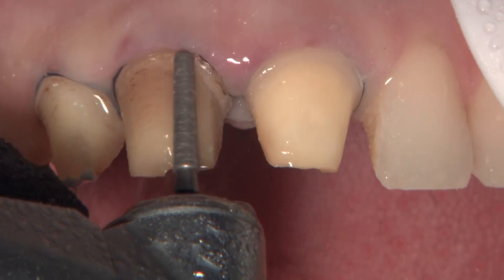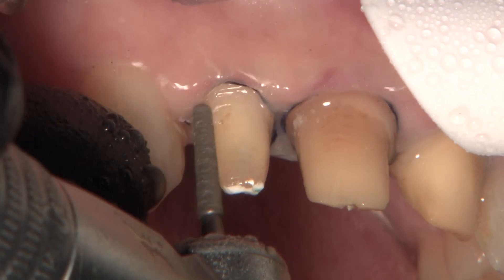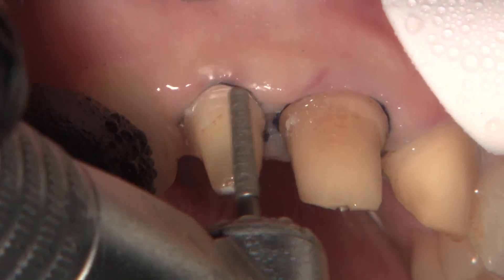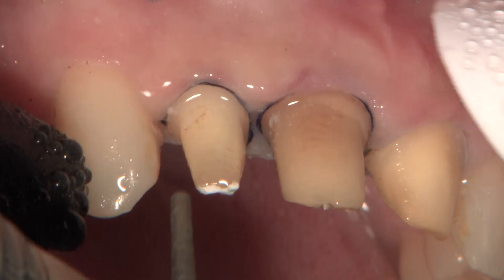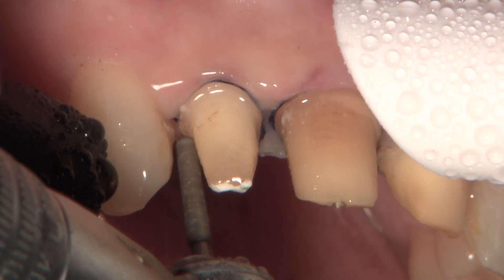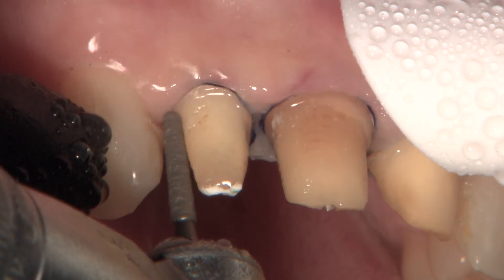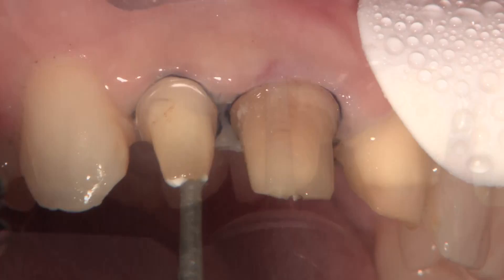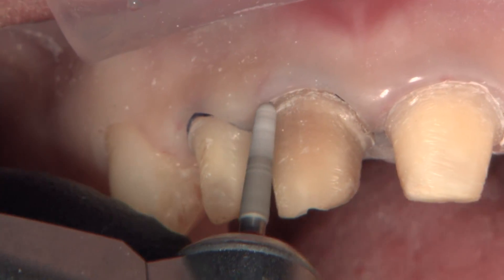I'm cleaning up the discoloration at the old margin of where the PFM was. You can see there's actually a decent margin on that tooth — typically you see a lot of feather edge margins on PFMs, but here we've actually got a pretty well-developed deep chamfer, shallow shoulder. That's going to work just fine for Bruxer anterior — in fact, that would be enough margin for an Emax crown as well. I call it a universal margin: one that will work for almost any type of restoration.